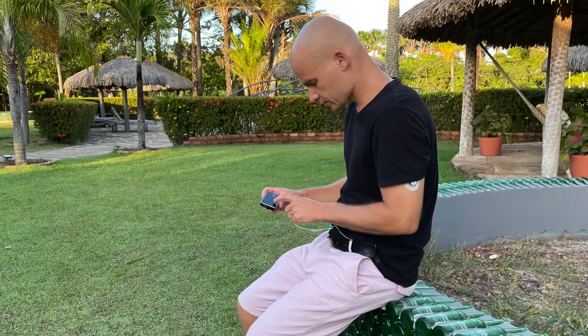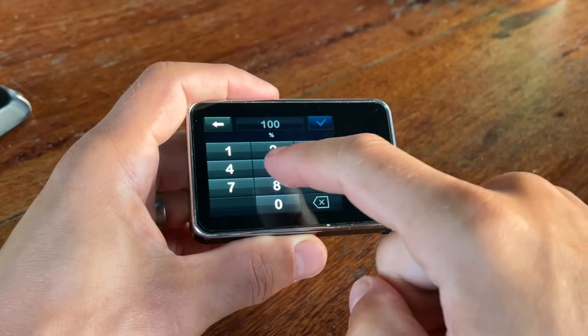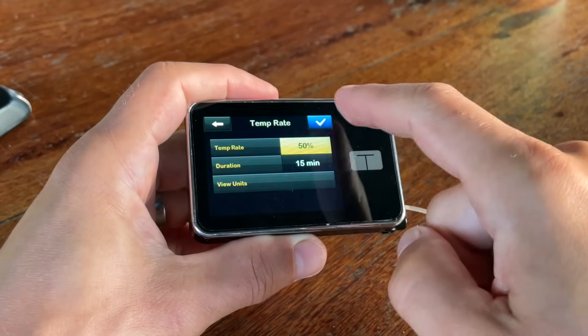You also have the option to temporarily increase or decrease your basal rate for a given period of time, just like with most other pumps. Now it might sound like there's a lot I love about this pump — and there is — but I have some more things I don't like that I'll get to in just a minute.